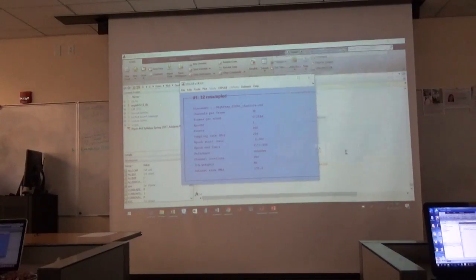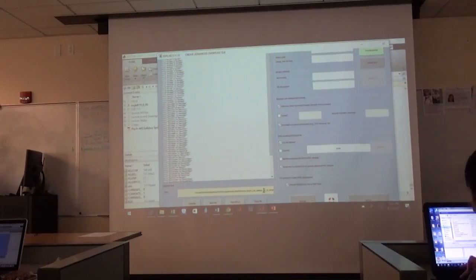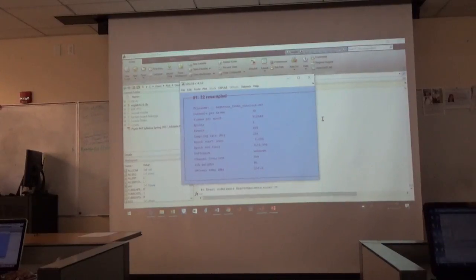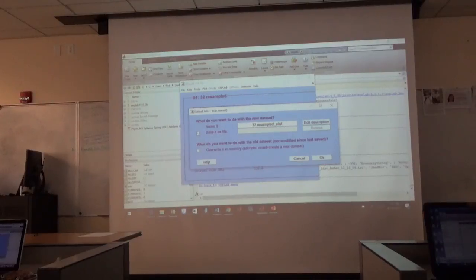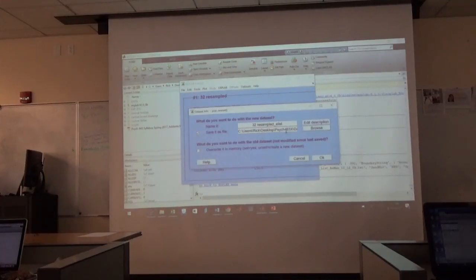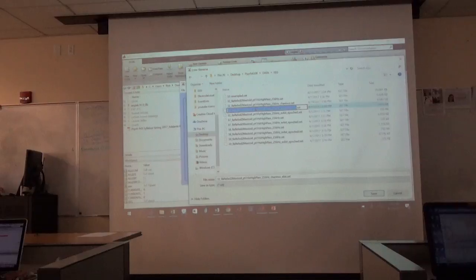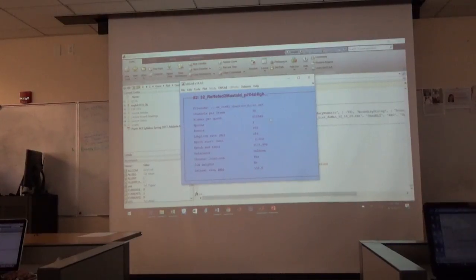So from here we clicked Advanced Events List that we created, and we loaded up a file that we now have loaded up for us conveniently. It was Advanced Events List nman-12-16-9, and we just hit Apply, and that created a list of all the different events. We selected numeric codes when it asked us, and we applied that. And then it even asked us to save it as a file, which we did. We went and saved it, and I believe we saved it as that. So we saved it like that. So now I should be caught up with you guys, with exactly where you are, right?